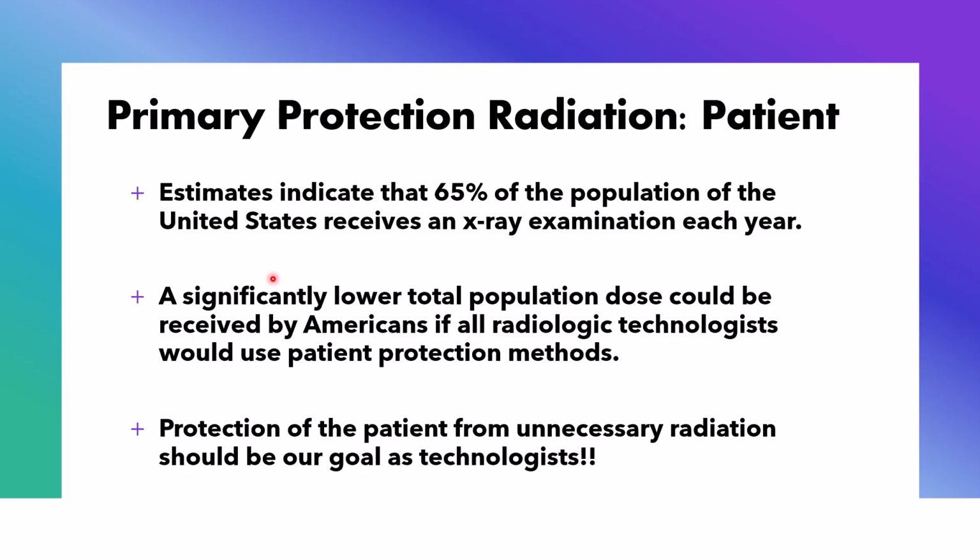methods. In other words, if all technologists and all radiologists did their job the best that they could and used ALARA, as low as reasonably achievable, you would reduce the dose to the patient by doing fewer X-rays, by not having to repeat X-rays, by doing X-rays correctly, by not fluoroscoping longer than they need, or by not ordering exams that a patient does not need. Protection of the patient from unnecessary radiation should be our goal as technologists. This should be an overriding thing that you are the patient protector.